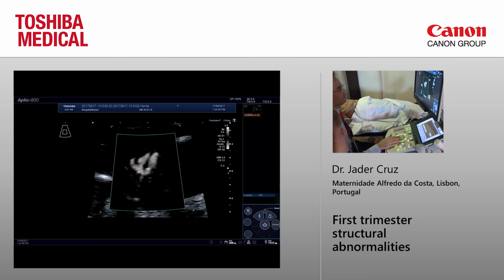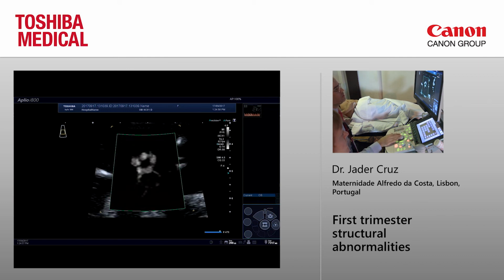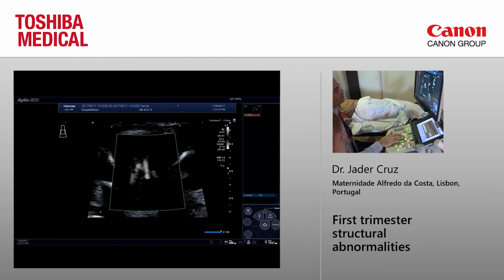So you see that's very clear. Yeah, you see the aorta. You can see that, yes? Then you see the pulmonary artery with the branching. And actually you see something very nice, because you see all the branchings of the pulmonary artery when you have a nice view. That's not really clear here, but you can see the left and the right branching and the duct. So it's really nice there. And that's what I'm talking about. You can see the 3 vessels in the 3 vessel view.